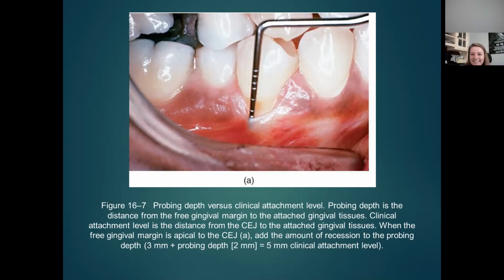Now, in your periodontal probing, math-wise, it might look like there's a defect because it's 0 millimeters or whatever, but you also want to go in and take a look at the suspicious areas to see where the probe tip is in relation to that junctional epithelium to determine if it's a true mucogingival defect or just a wannabe, like something that you need to keep your eyes on.